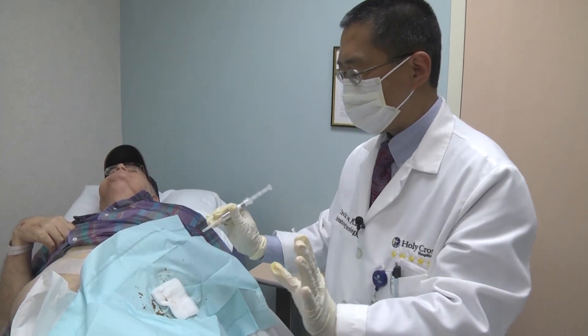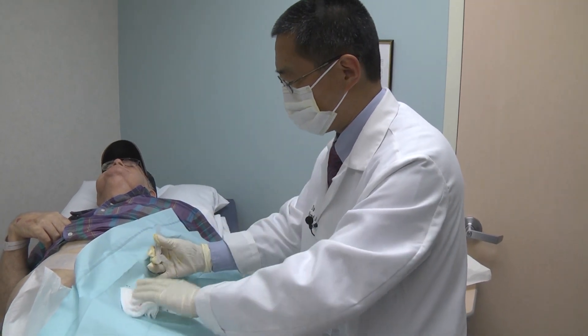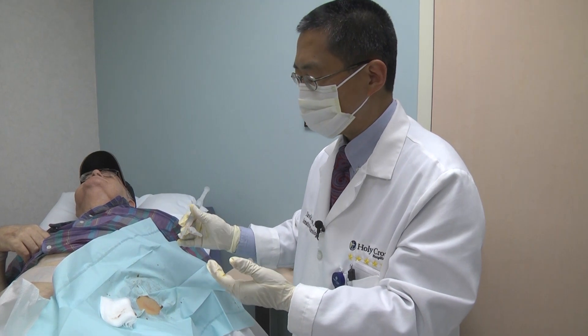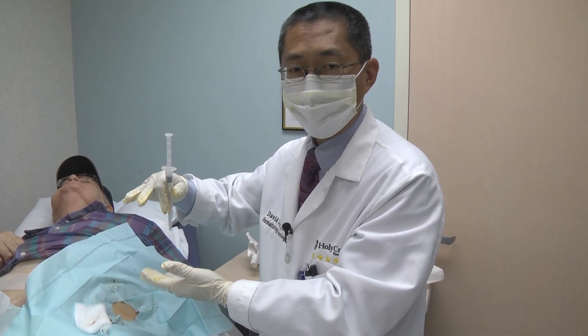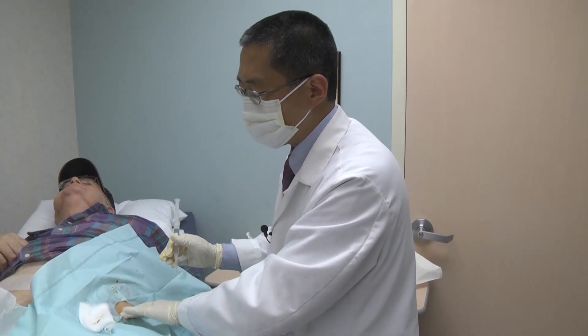The first step is numbing. Numbing is the most important part. The reason why the procedure becomes painful for many people is that we do not numb enough, and sometimes we numb one spot and put the needle into a different spot. For a thick tissue layer, it's easy to miss the spot. For a thin layer, it's relatively simple.